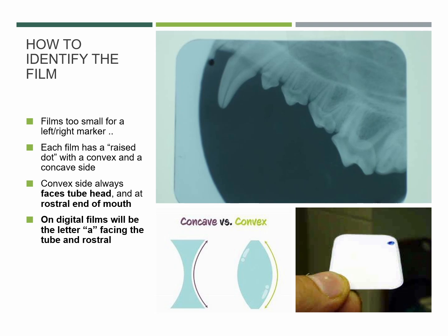Now you're probably thinking, duh, there's a canine tooth. But we're working backwards. When you're dealing with something like a premolar or a molar, you might not be 100% sure exactly where you're located, so that dot and that A are going to be very handy.